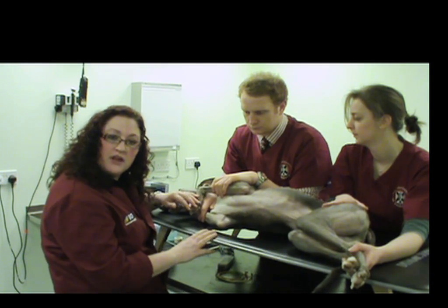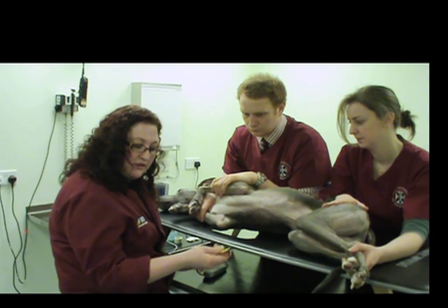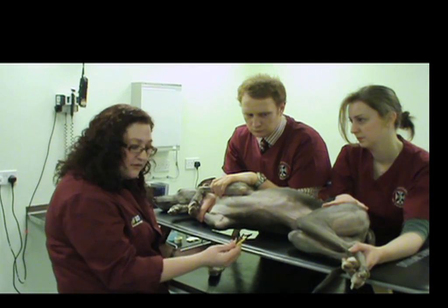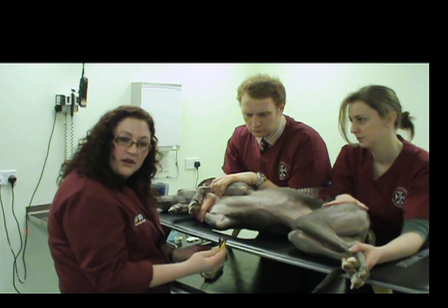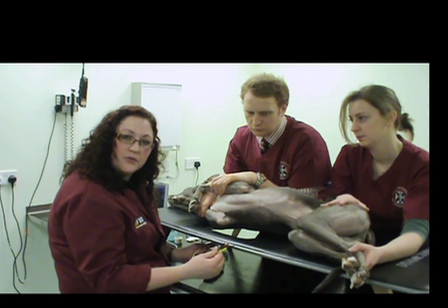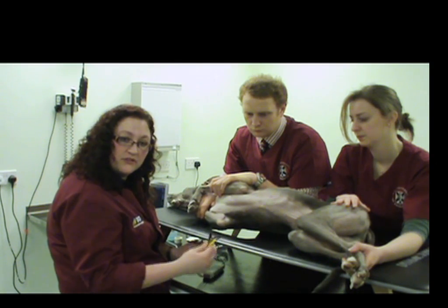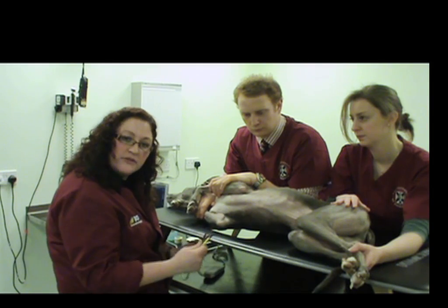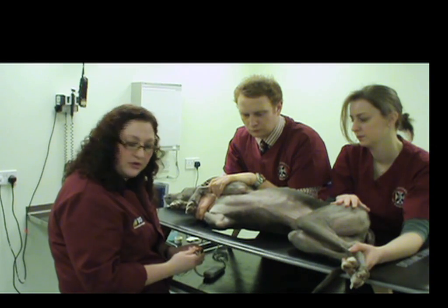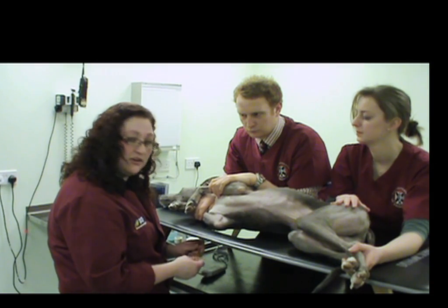Another capability some machines have is ECG function. This is where the ECG leads are connected directly into the machine feed, enabling a simultaneous ultrasound image alongside the electrocardiogram. This allows us, when performing measurements and calculations, to select the right point during the cardiac cycle. We won't be using this today, as we're focusing on getting started in the general practice setting where not everyone has this available, but we'll show you some ways to work around this in your normal practice.